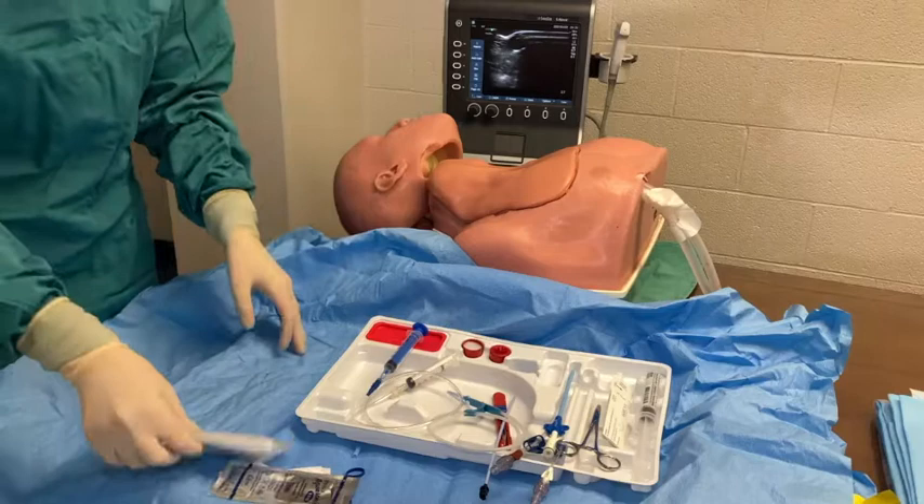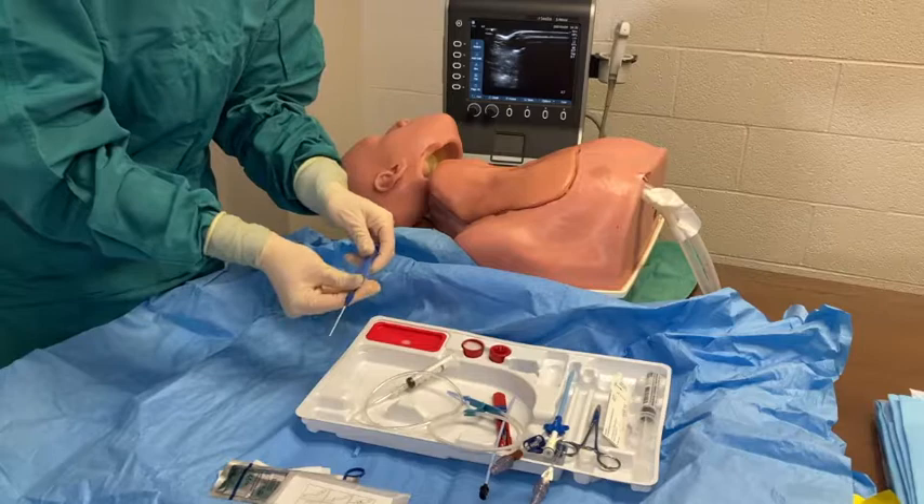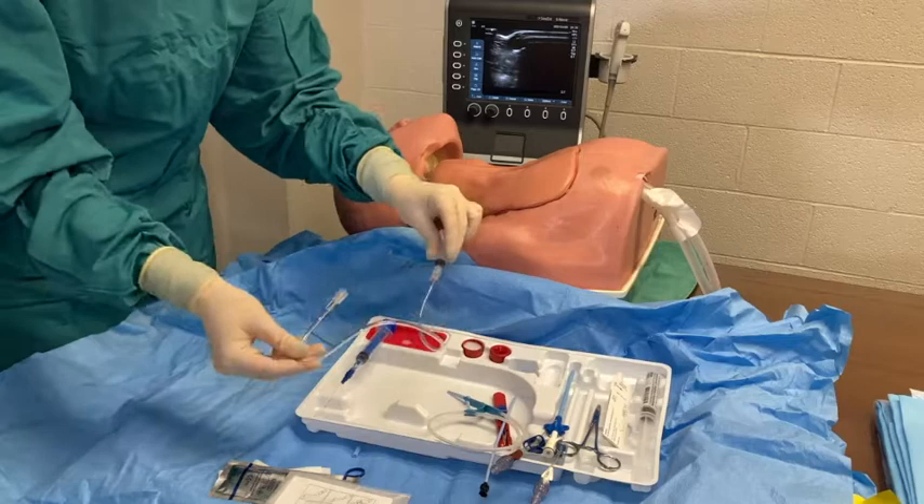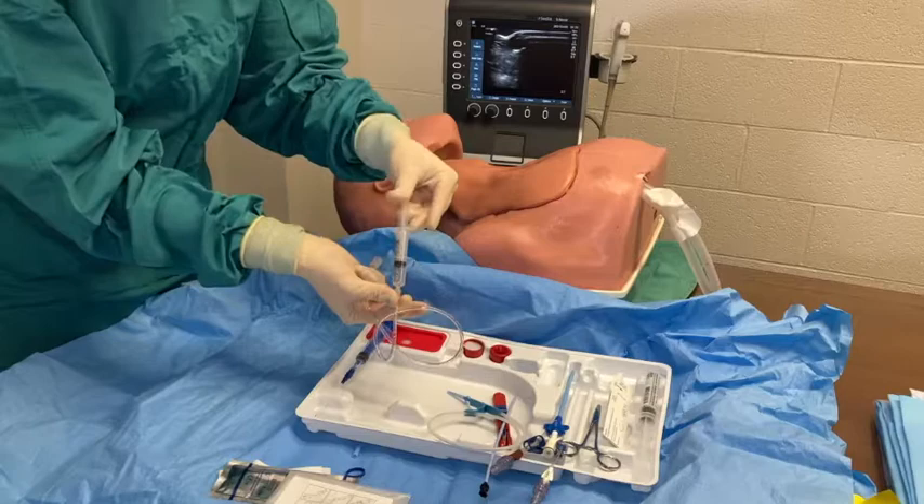I have set up the kit in the order of placement steps. First comes the angiocath. Attach the angiocath to the blue syringe. Pull back on the syringe and slide the catheter off the needle to check. Attach a 5cc syringe to the manometry tubing.